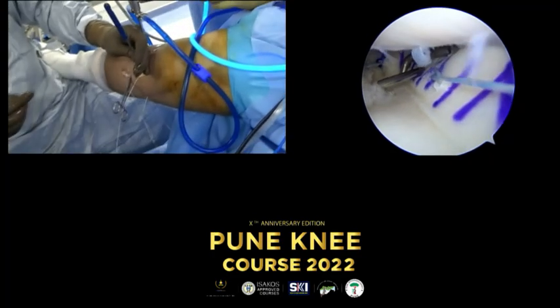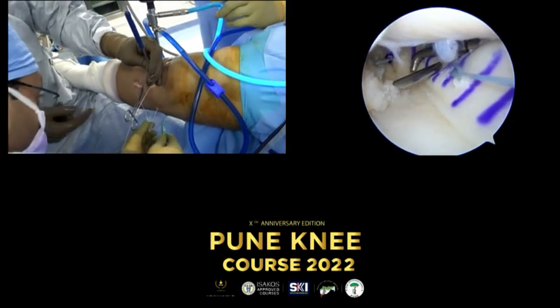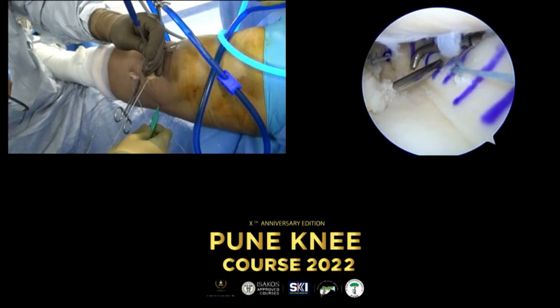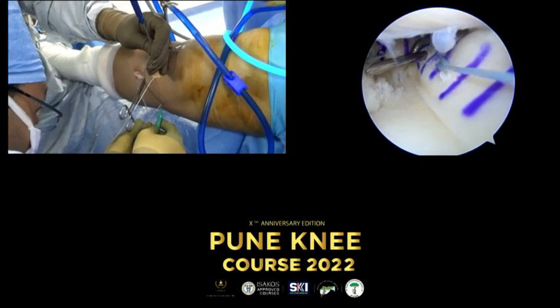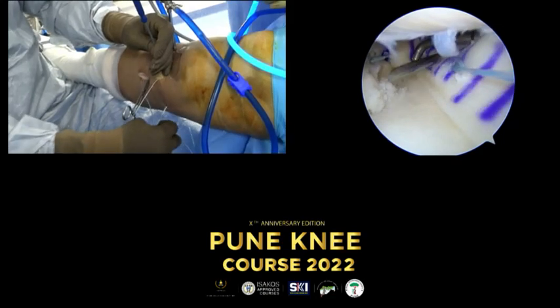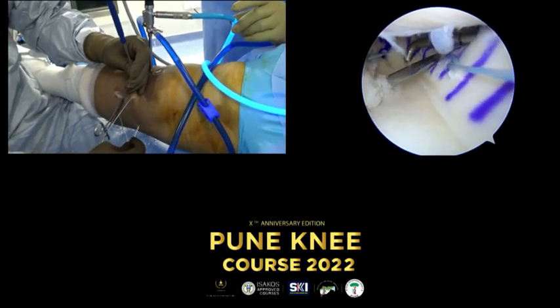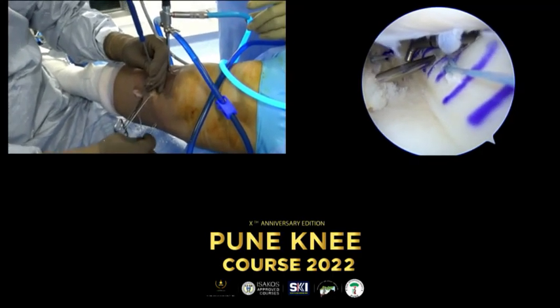There we go. Can you make a stab incision, another spinal needle, stab incision for you, just right here. Pablo, any particular reason you don't like to use inside-out sutures? I normally don't use them, I almost always use all-inside for the body. Now we have this problem with it being a little bit above, but normally I don't need it. I repair all these aspects with all-inside. And the anterior aspect? Yes, one or two, like what we did before. Okay. We already did it.